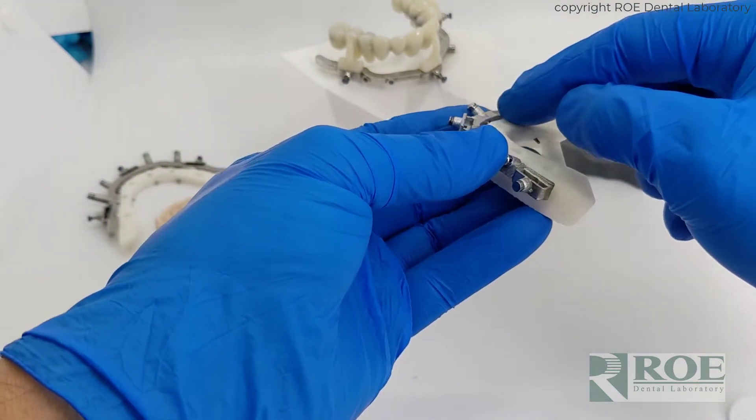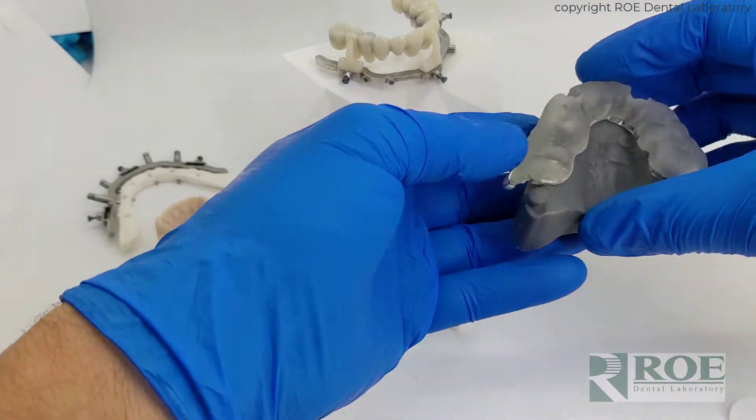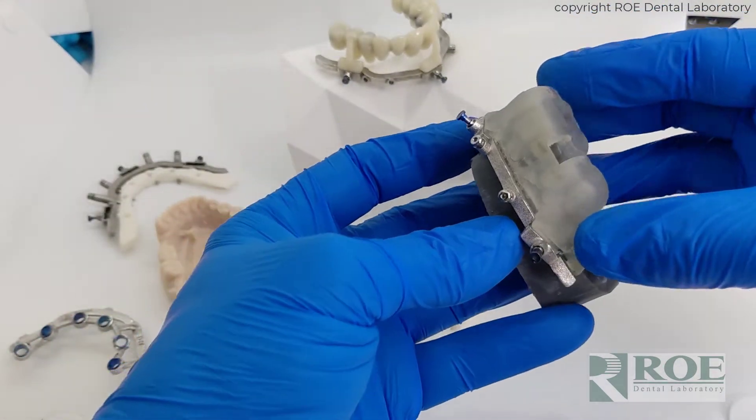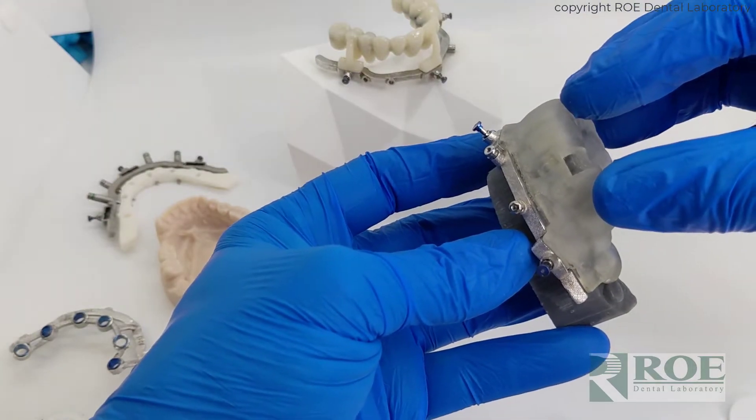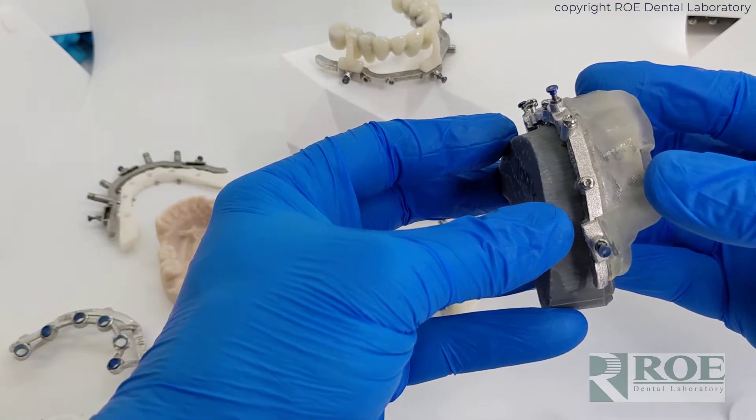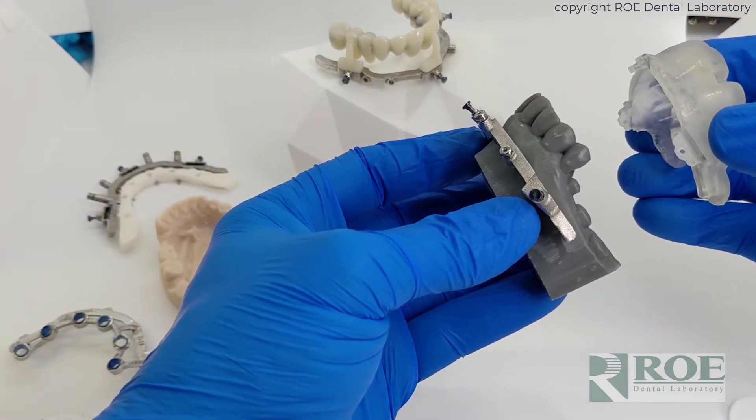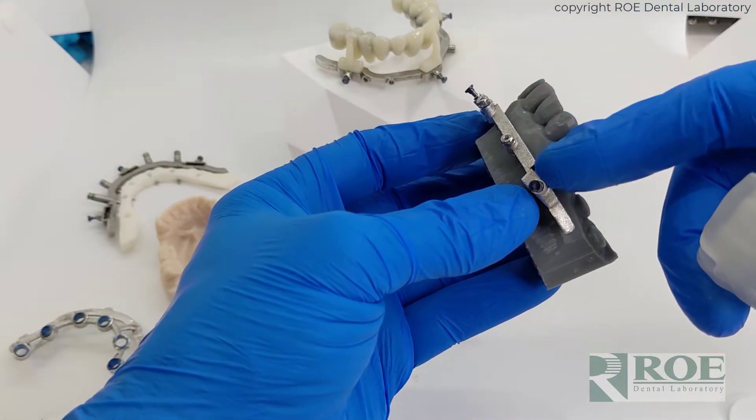Now what this means is that you do not have to reduce the bone to get the guide to seat. In fact, our fixation base is delivered via the pin guide to support it while it is attached with chrome locks to the fixation base. So you can see in this situation, there is some undercut, but we don't have to contact the bone.